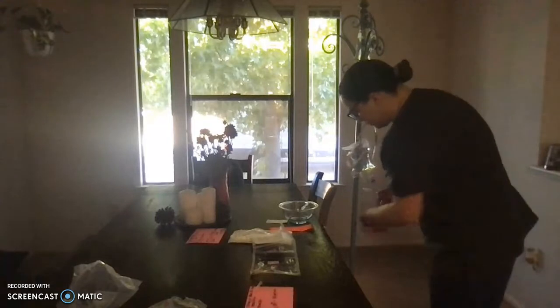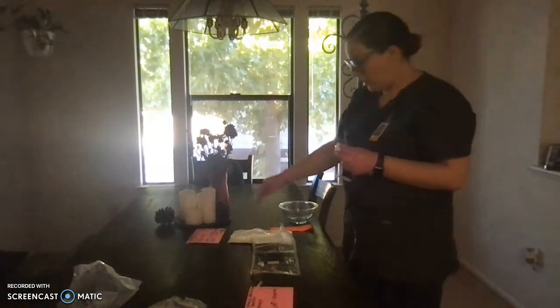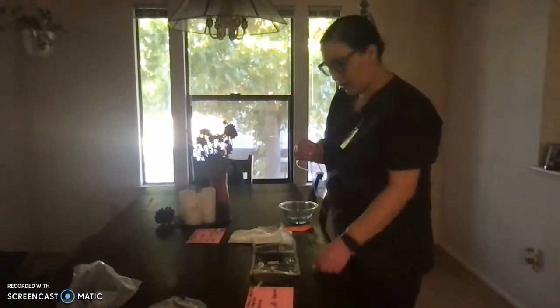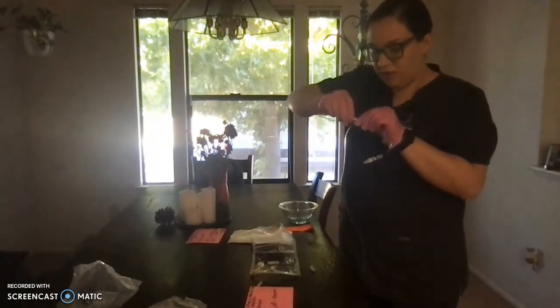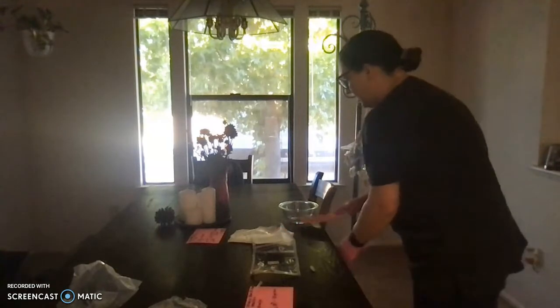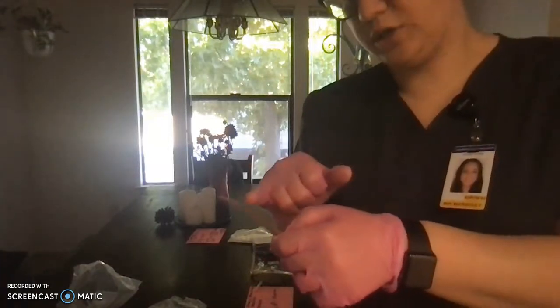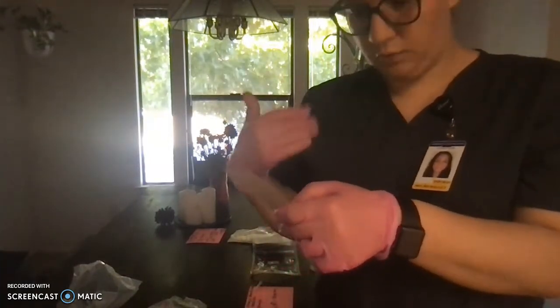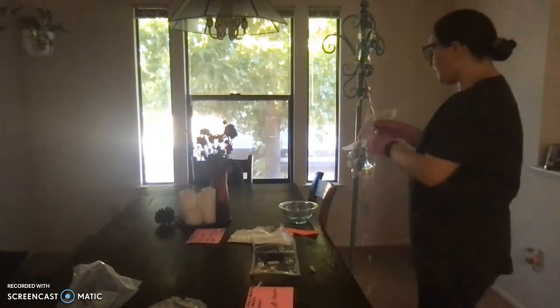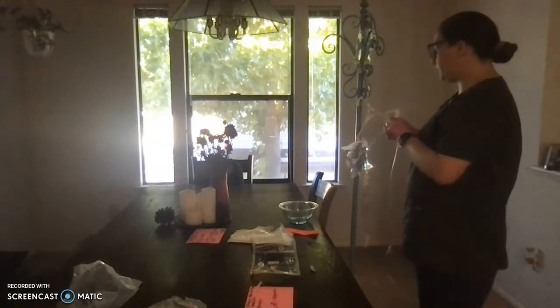We are going to wipe off our Y site with an alcohol wipe, letting it dry before we connect the two. Then you're going to connect, pushing in the luer lock and twisting, as well as going over making sure that you did your medication added, patient, drug, amount added, by who, and when you started it, all that on your handy dandy sticker on your piggyback. And then of course you're also going to want to fill your drip chamber, and you are going to count for 1 full minute.